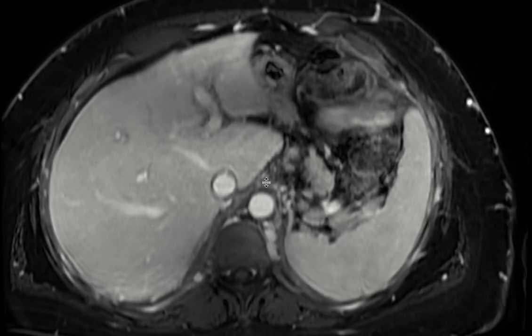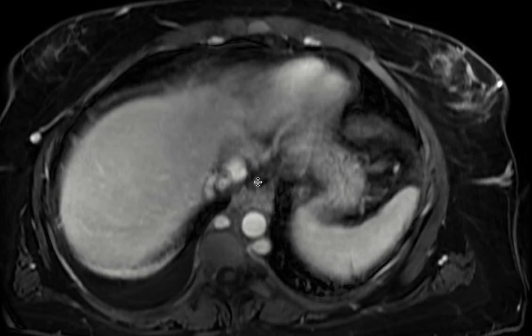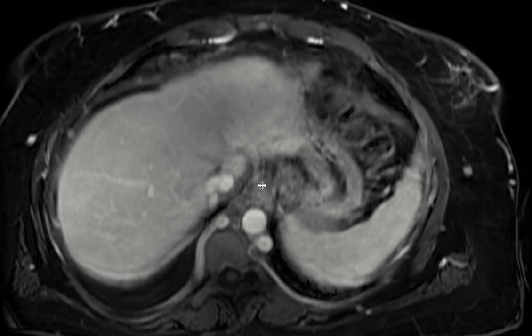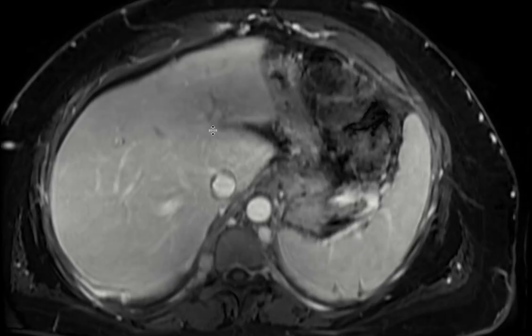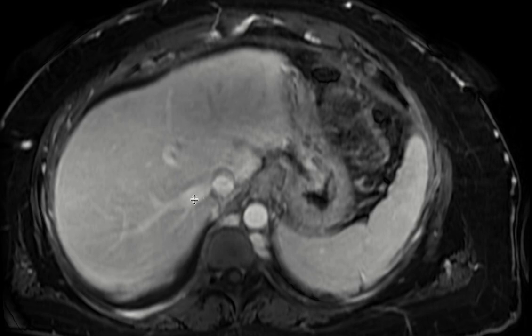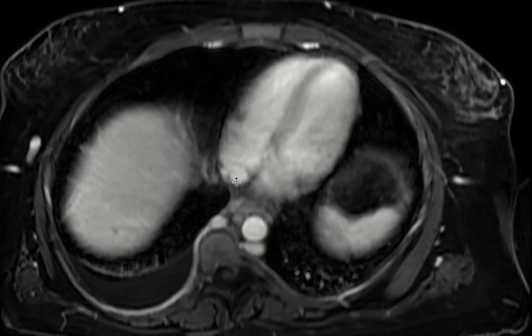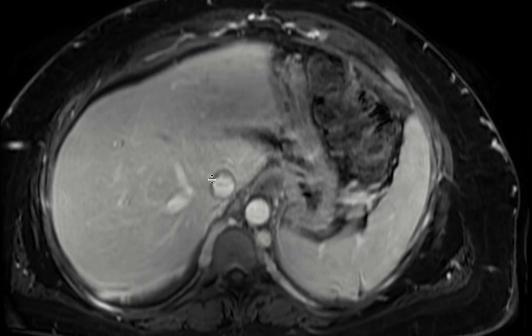So this is actually a patient who has Budd-Chiari syndrome, and Budd-Chiari is occlusion or narrowing of the hepatic veins or the IVC, leading to a congested appearance of the liver. And so this is the reason why we're getting these flattened waveforms, because there's not great communication. Even though this right hepatic vein is patent, you're not getting great communication between that and the right heart to be able to have the normal appearing waveforms.